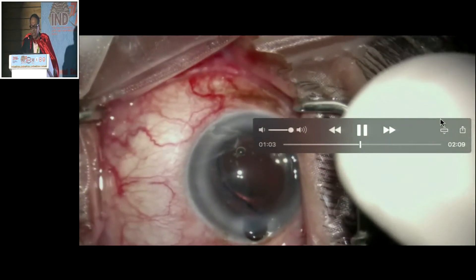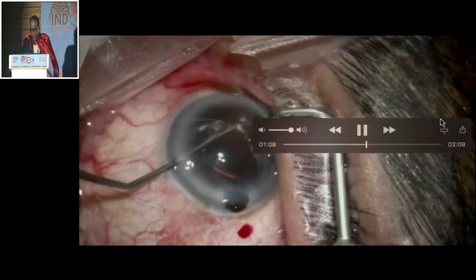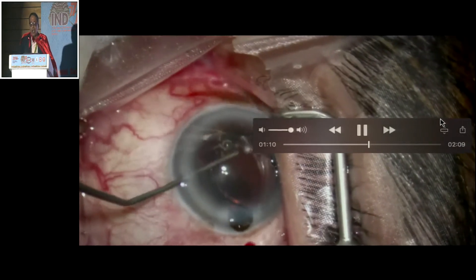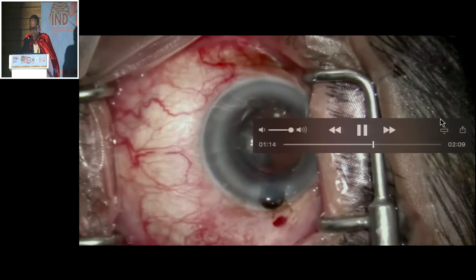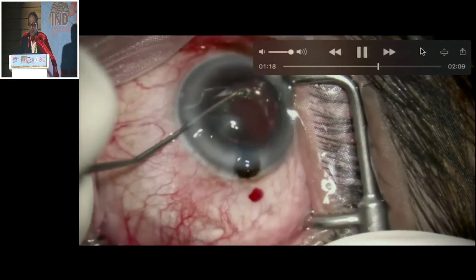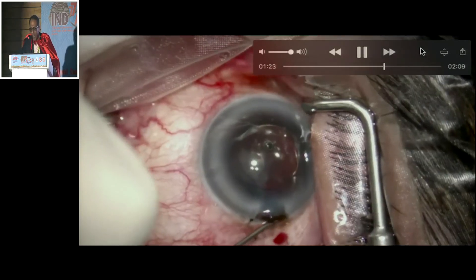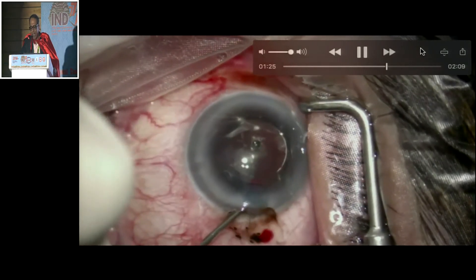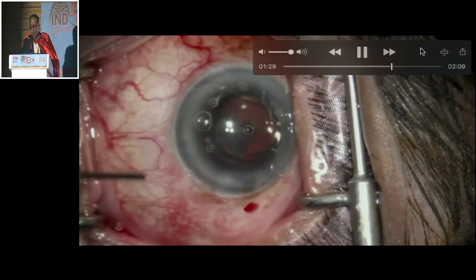The iris starts coming out. I go through the side port and push it down. The vitreoretinal support at this point of time is not available. The question is: what should I do next? I think I should put air after putting the iris back into place. It is still hard — what to do? Somehow I am able to put air.